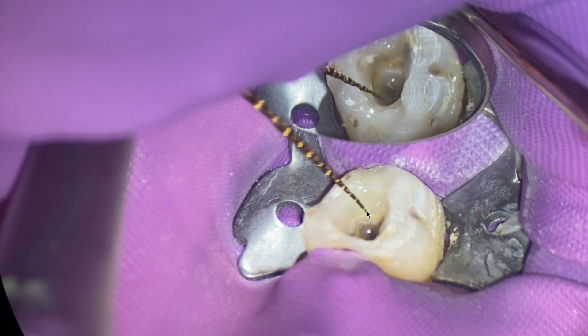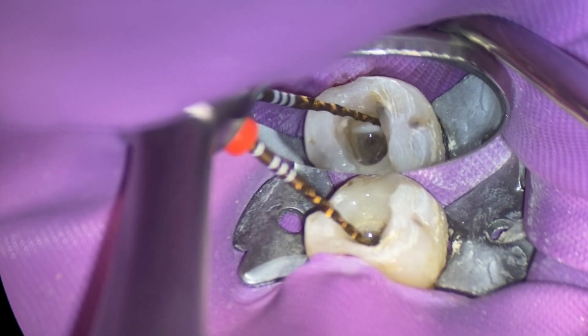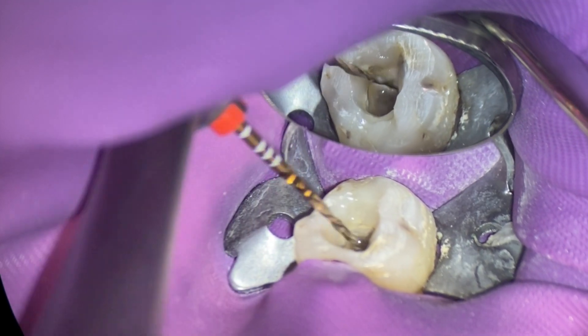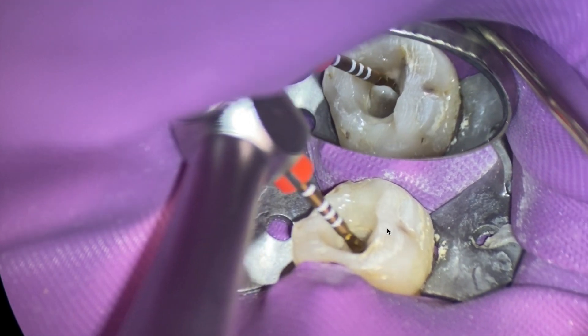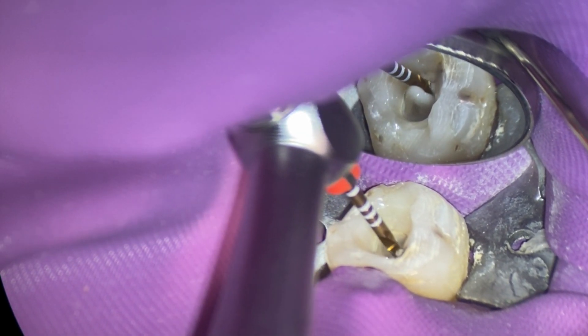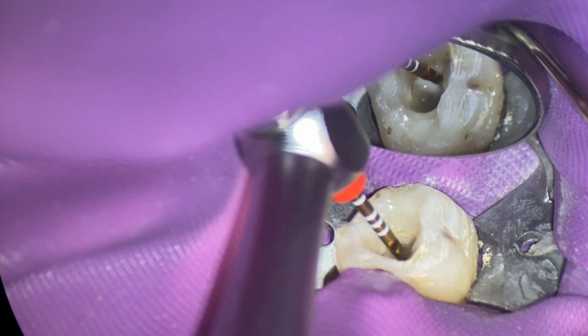So this is really simple — all I got to do is ask for a new file. Down we go. What happens is a number of things: one, we limit the probability of having that fracture. Then two, my confidence goes back up. This was a four canal molar, it was moderately calcified, the canals were fairly difficult to get down, and that file was just not making its way. Reciprocating files are a little bit slower, but I love them because I find they're much more safe.